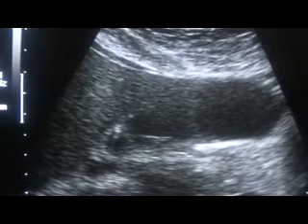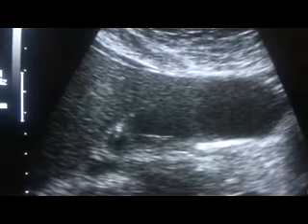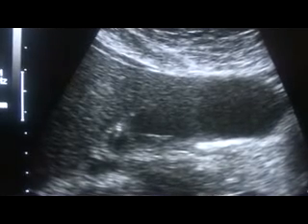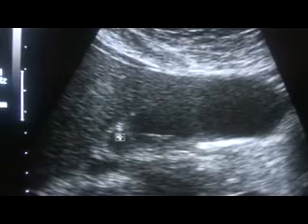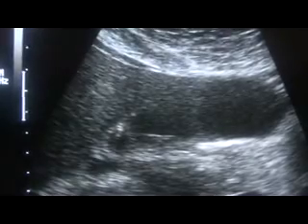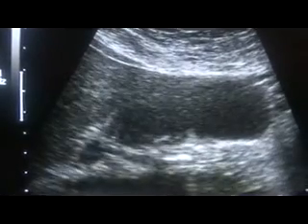Now this is the gallbladder, in which you are seeing this echogenic area giving posterior sharp shadow. This is the calculus. This is the largest of all, and this measures 7.2 millimeters. The rest, all of this is the gallbladder.